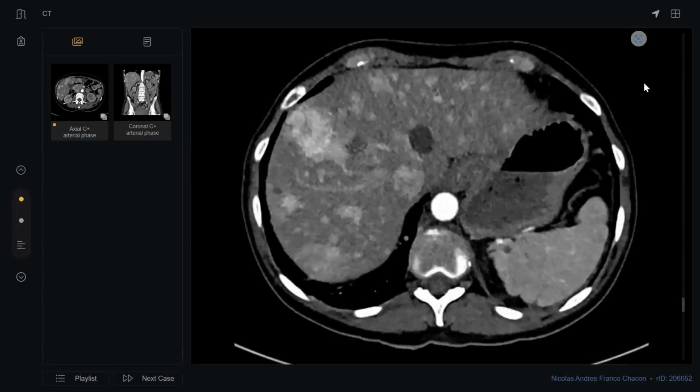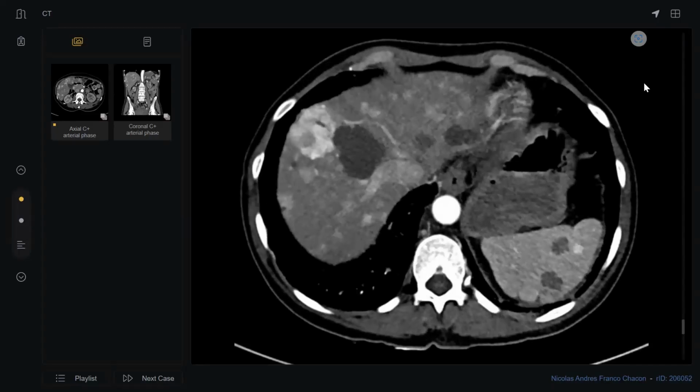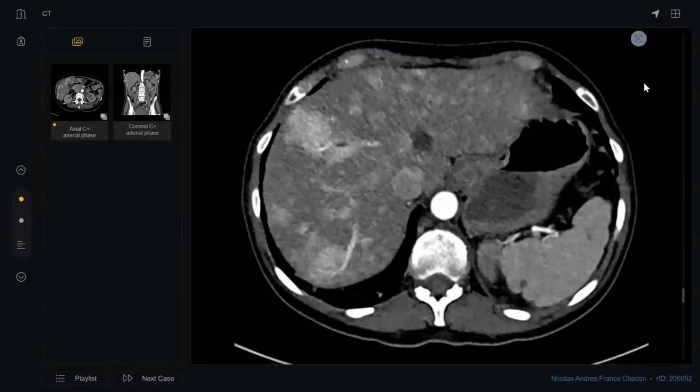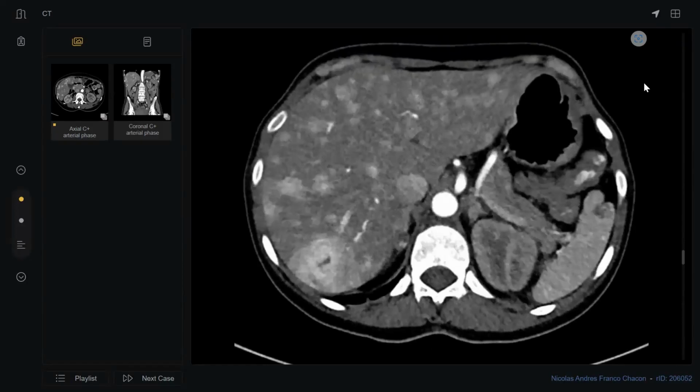Multiple liver and spleen lesions. What is this? Tell me. Metastasis. Okay, very easy. I'm looking for the primary. Very easy. See, you take about 3 minutes without telling the examiner, okay, doctor, this is metastatic. So you should tell.